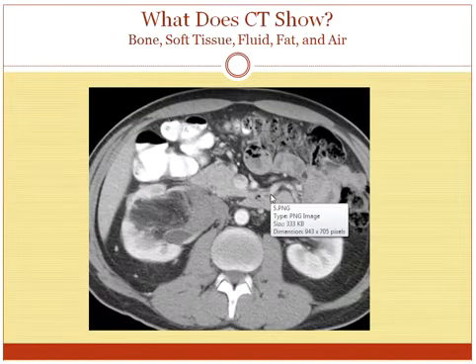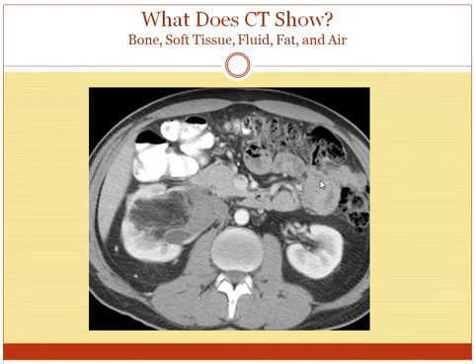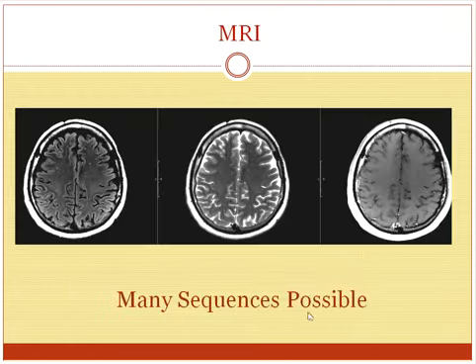And this is just a picture of a CT scan. Again, a CT scan is just an X-ray, so things look like they would look under X-ray. This is dense contrast within bowel, so this looks really white on the CT, just as it would on an X-ray. This back here is bone. Remember, bone on CT scans looks really white. Over here is air on the outside, and this is fat in the body. Both of these are really dark, and on X-ray, again, air and fat are really dark. And this is soft tissue here, this muscle back here, this is the liver, and this is muscle around the sides.